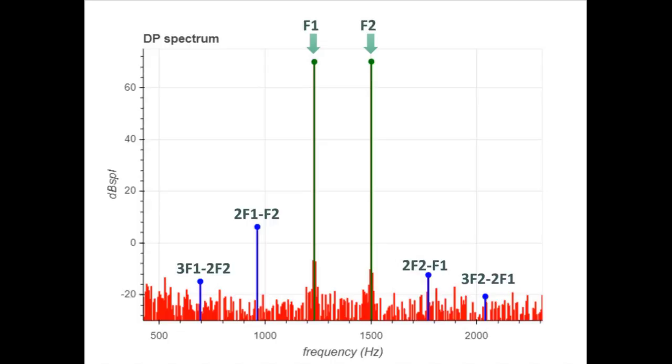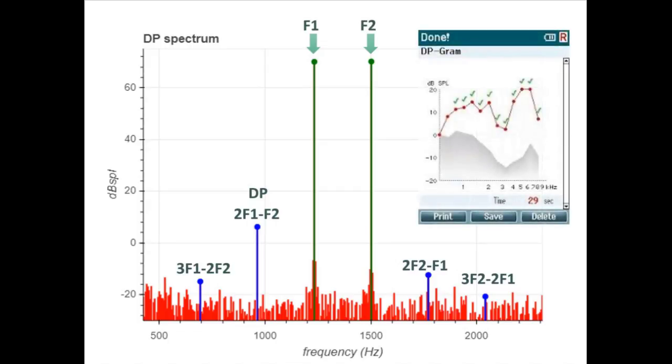They're intermodulation distortions. And clinically, we look at 2F1 minus F2, as that's the one that's most robust clinically. Although you don't often see a diagram in that detail, what we're more used to looking at is a picture like this, because we've performed multiple measurements to obtain that picture. So we've performed the DP measurement at different frequencies, and that graph shows the height of the DP, the 2F1 minus F2 component, and the noise in grey, which is derived from the red bars in the large graph.